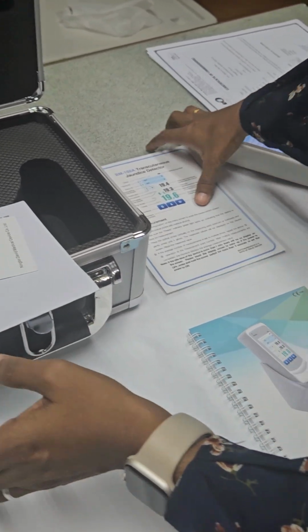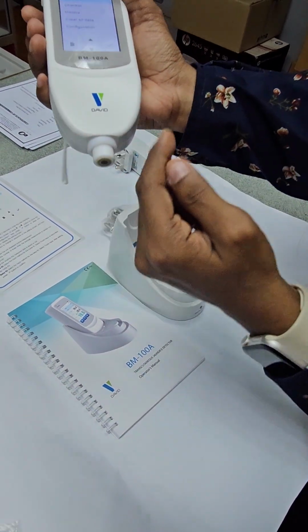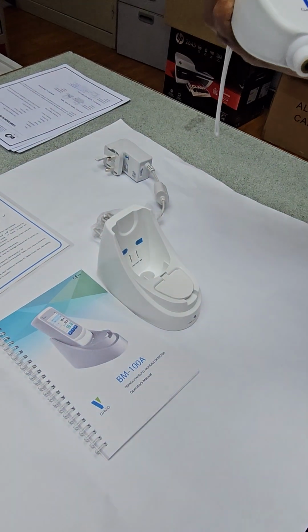How do they normally maintain it? Each time they use it, do they need to clean it? No. For every new patient, they can clip here, and use an alcohol swab to clean this. That's all.